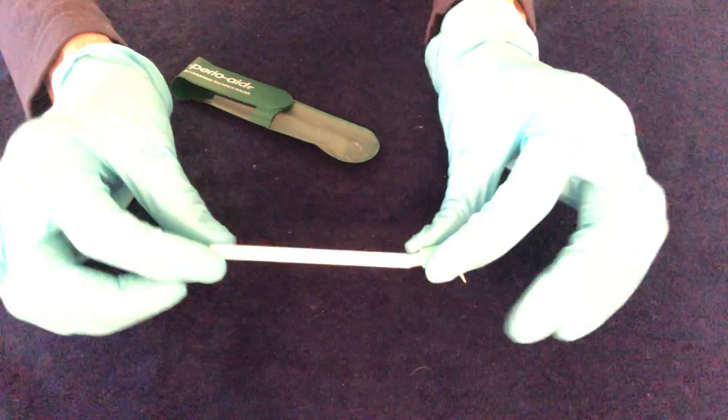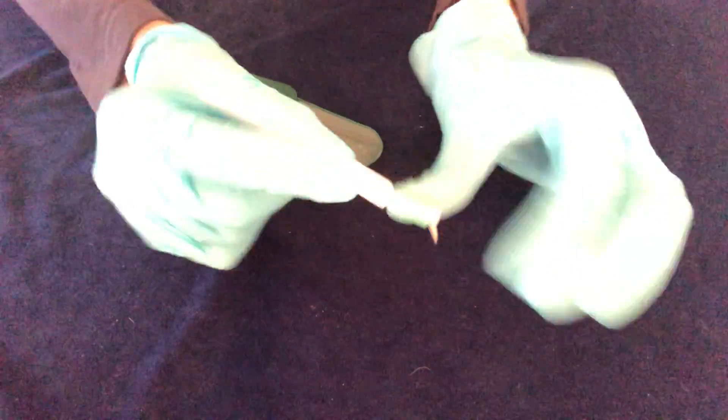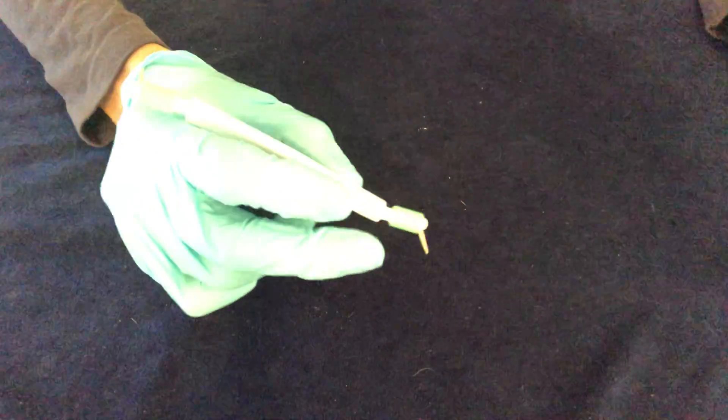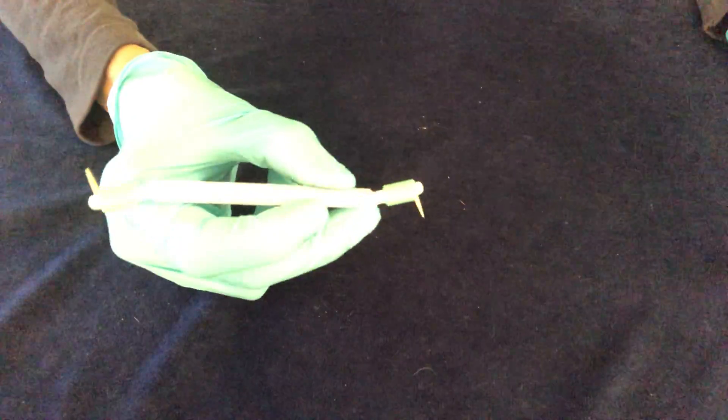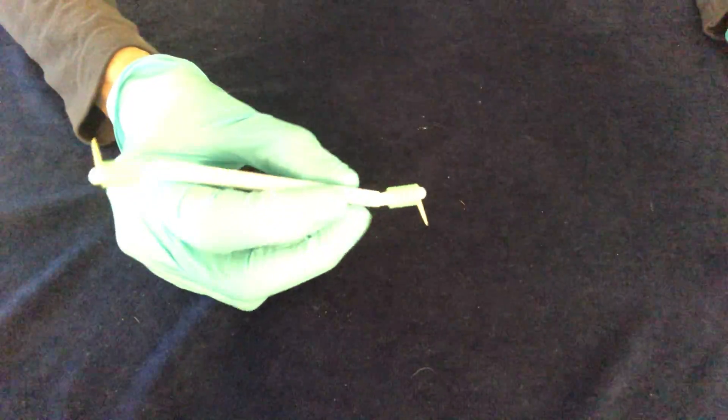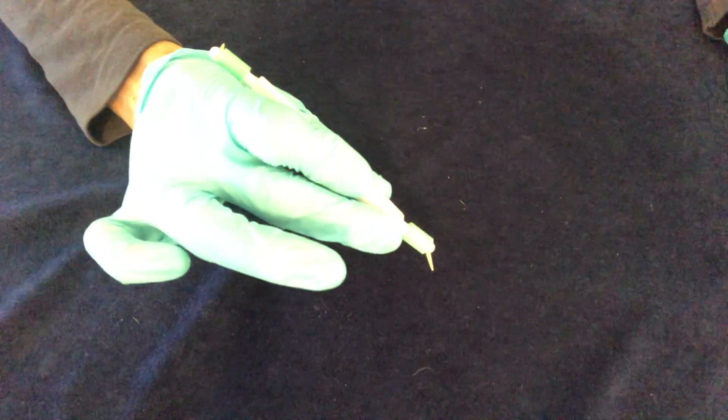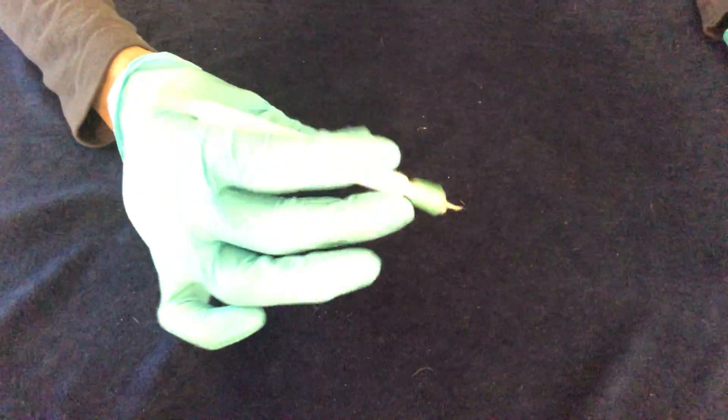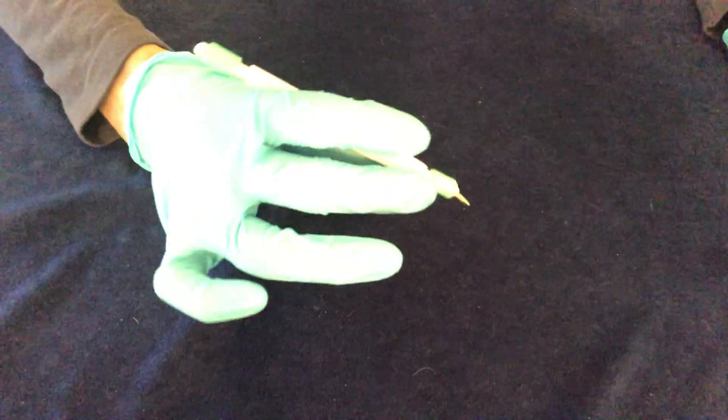You want to hold this with what we call the modified pen grasp. We hold a pen or pencil with two fingers like this. Modified pen grasp is with three fingers. You can hold it with your knuckles, tips of your fingertips, cradle it this way, roll it around. Just practice rolling it around in your hands.